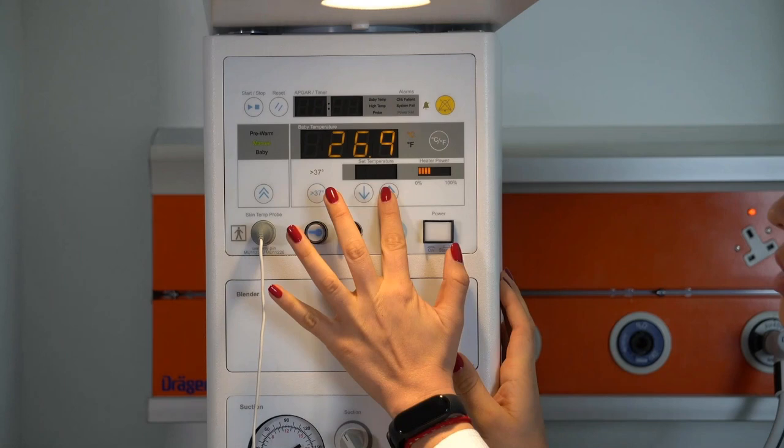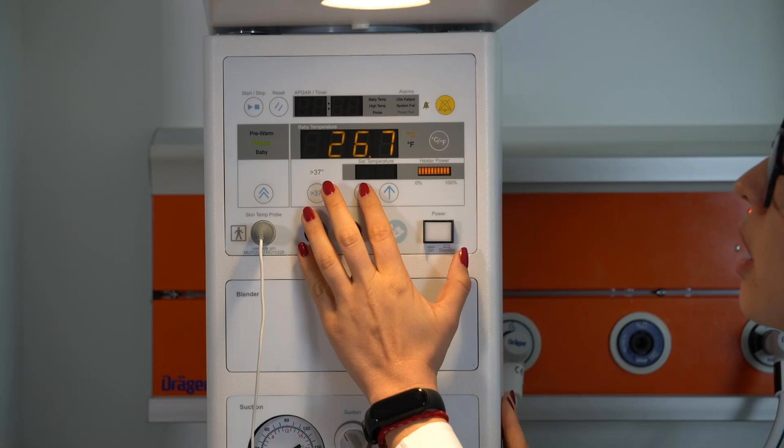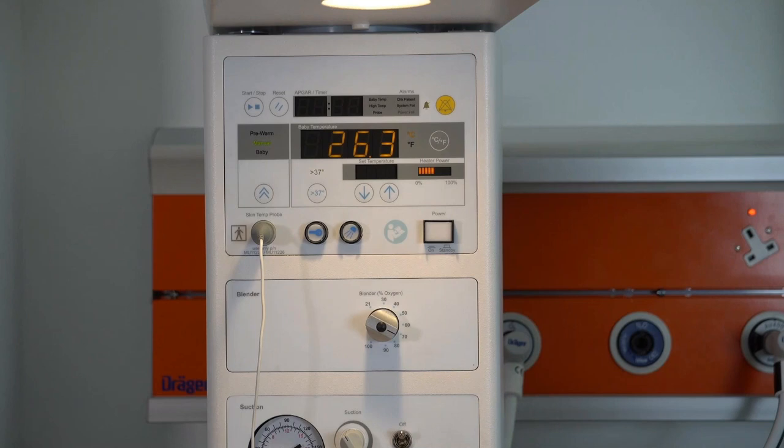to a maximum. If, for example, we clearly see that the baby is very cold, we need to increase the output to the maximum. However, if you see that it's too hot, we can also reduce the output to lower. So this is the so-called manual mode.